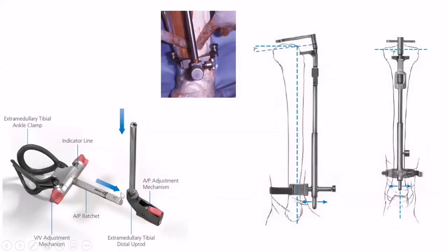Remember that this one can control the AP diameter adjustment, and remember that the varus and valgus must be aligned firmly so that when you cut the proximal tibia, it will not show a varus or valgus cut. It must be perpendicular. There are some cases where we don't need a slope. The first situation is the presence of flexion contracture. When you have a flexion contracture with the posterior slope, it will add more contracture and it is difficult in extension. So no need for a slope here.